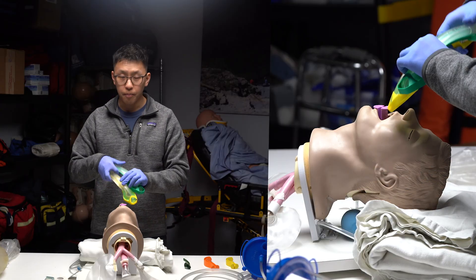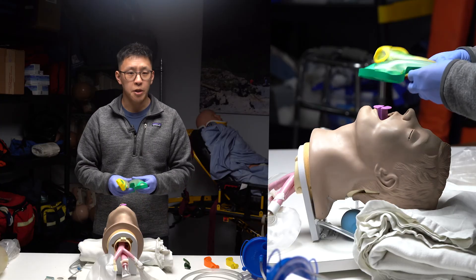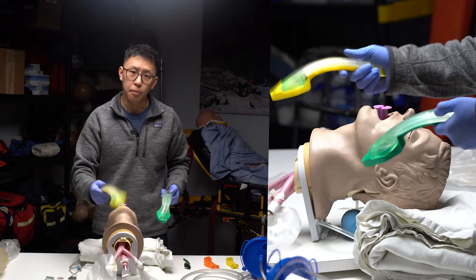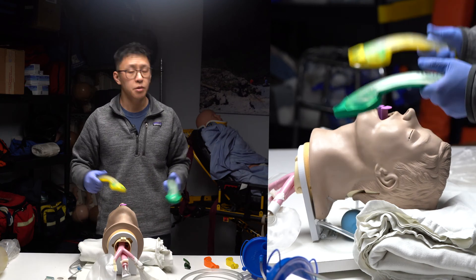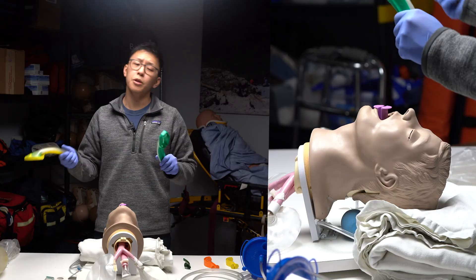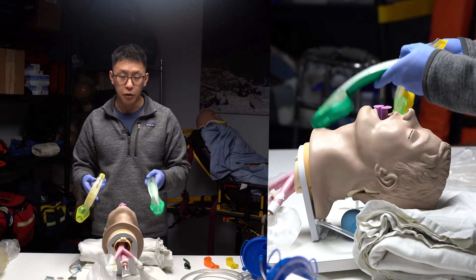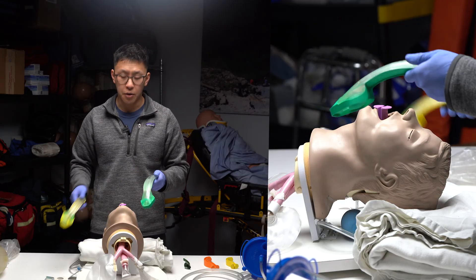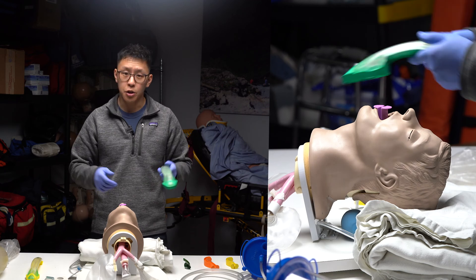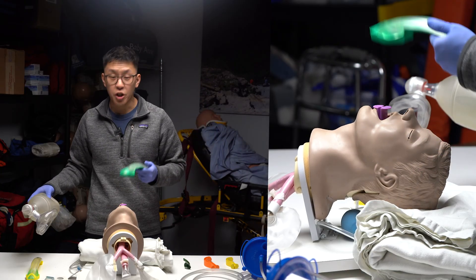The current supraglottic device we're using is called an i-gel — we used to use king tubes. King tubes are measured by height; i-gels are measured by weight. Guesstimate the patient's weight in pounds and divide by 2.2 to get kilograms. Size 3 ranges 30–60 kg and size 4 is 50–90 kg. So for a patient around 75 kg, opt for the size 4. While preparing the i-gel, verbalize that your partner is continuing to ventilate every five to six seconds.